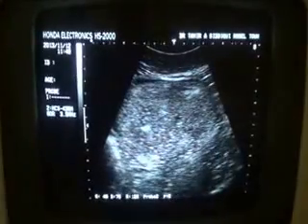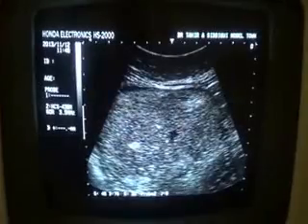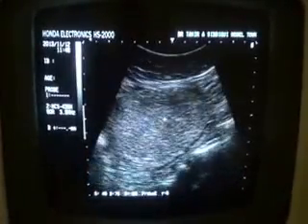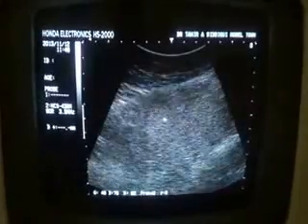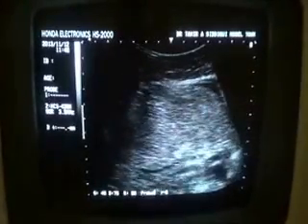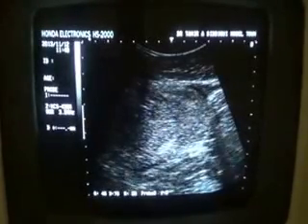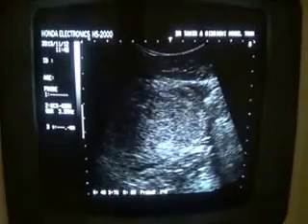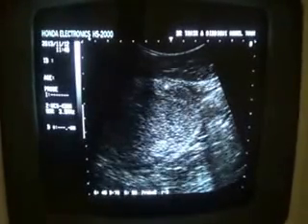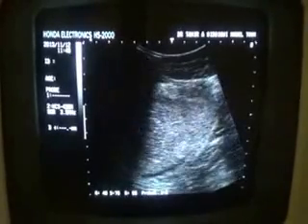See the internal cystic area. This is the tiny cystic area internally. This is the calcification. This is a solid mass with no posterior wall acoustic enhancement, with islands of echogenic areas. This is a rounded echogenic area with no posterior shadowing, and here you can see multiple anechoic areas within the cystic area. So this is in fact a complex cystic mass.